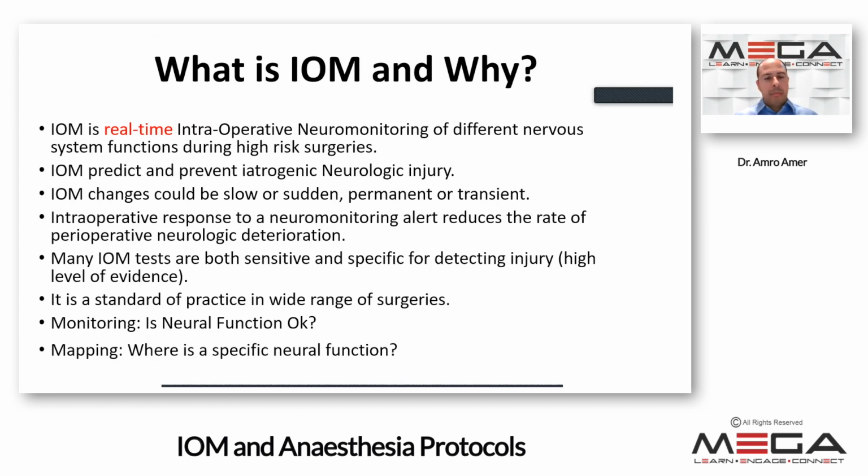Monitoring is divided into two sections: monitoring and mapping. Monitoring is a question of how the neurons are functioning. Mapping is where the neurons are, where the specific function of the neuron is, for example motor mapping, speech mapping, sensory mapping, etc. It's real time during surgery, and we give feedback to the surgeon immediately if there are any changes.